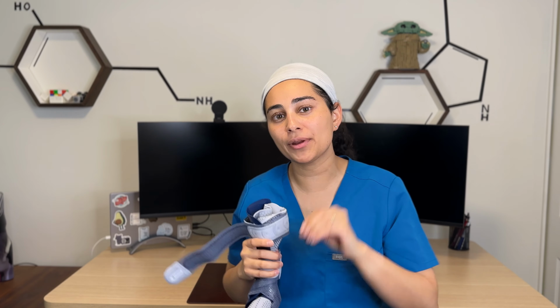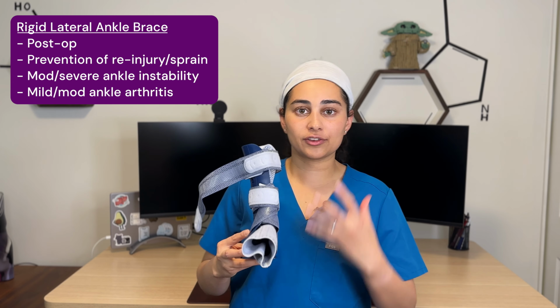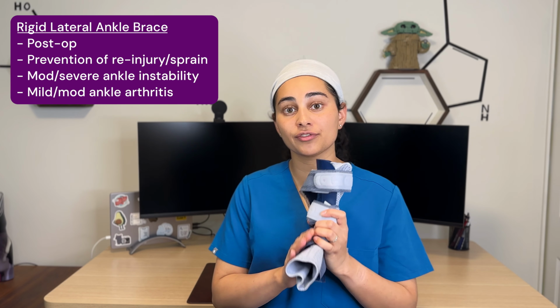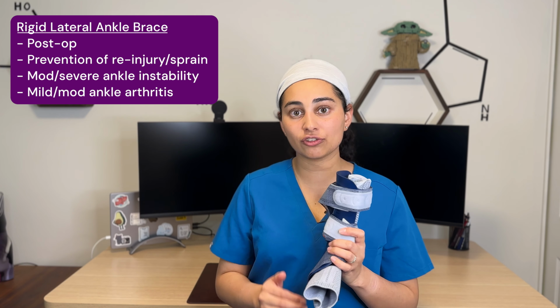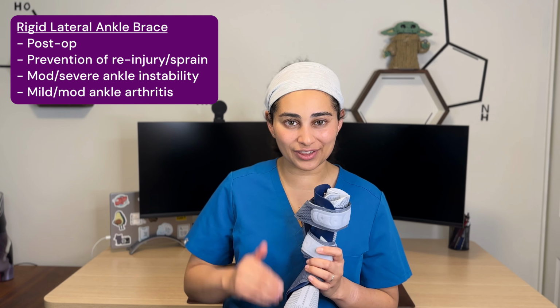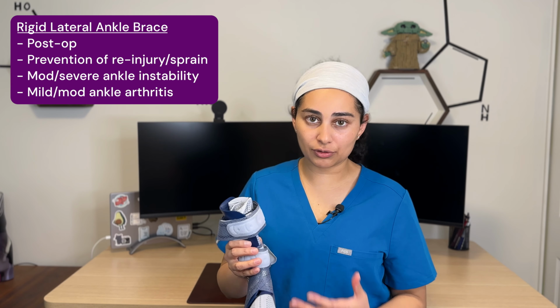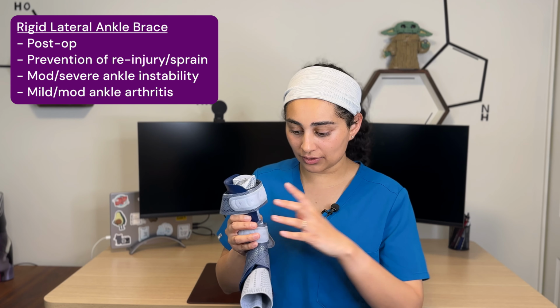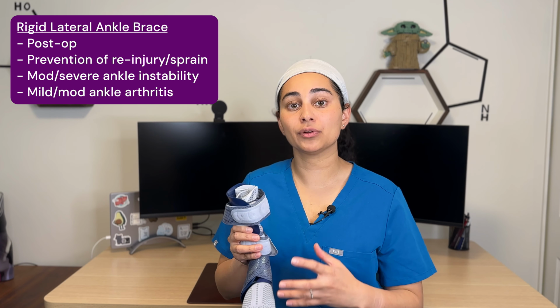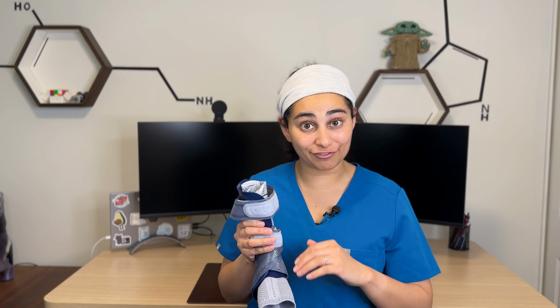And that is the most common mechanism of injury that causes ankle sprains. So sprains on the outside aspect of the ankle. So who would find this brace helpful? Because it's so rigid, this is very helpful in preventing re-injury. It can also be used as a post-op brace. Many patients will actually play their sport in this brace to help prevent lateral ankle sprains, for example, in soccer. And also it can be used in cases of mild to moderate ankle arthritis. In a lot of these cases, these rigid ankle braces can also help people with joint issues at the ankle joint because it doesn't allow the ankle joint to bend and flex very much.